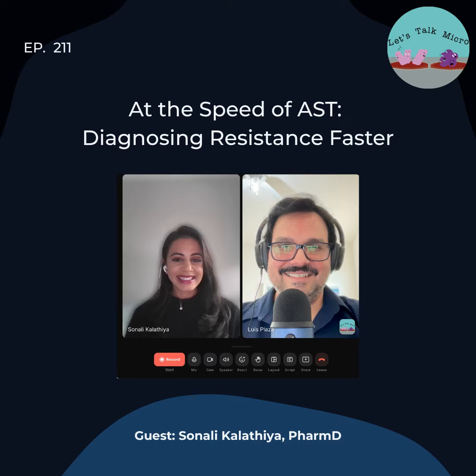So again, actionability is really key. I think the diagnostic test itself doesn't really produce the intervention, right? So you really have to tie the labs and your stewardship programs or your clinicians together to establish an efficient communication pathway, maybe diagnostic or treatment algorithms, education and training. All of these things would help promote timely and informed clinical decision making.